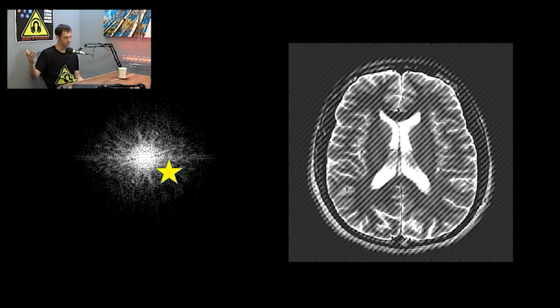Now, the lines show up in math speak, you'd say normal to that direction. So you look at the origin, the center of Kspace, and you point a line to where that star is, that line would go lower right. And those image space lines, the dark splotches, the corduroy pattern, is like 90 degrees opposite that. That's what I mean by normal.